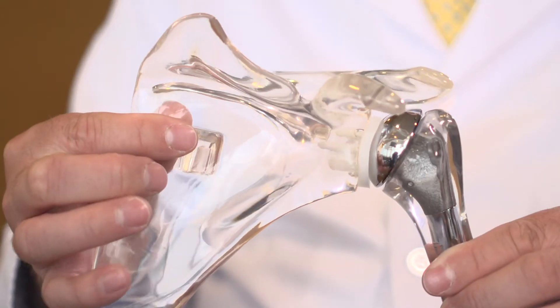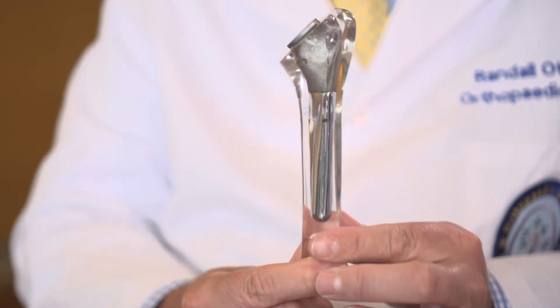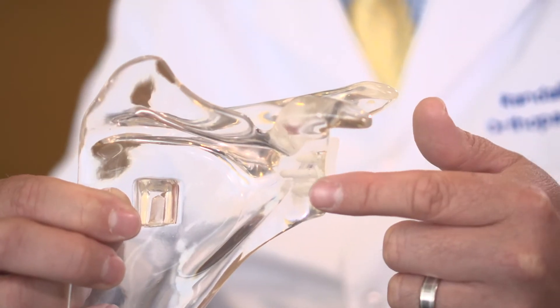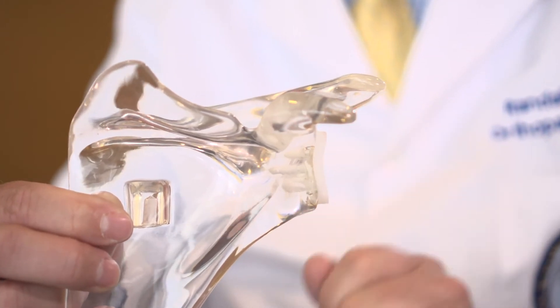This is the anatomic shoulder replacement. The clear plastic is the bone. You remove the cap of bone where the ball is and replace it with a metal ball, and then you smooth out the surface where the socket is and replace it with a plastic piece that fits onto the face of it.